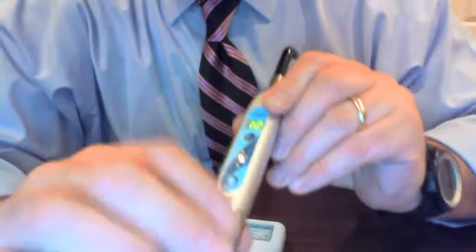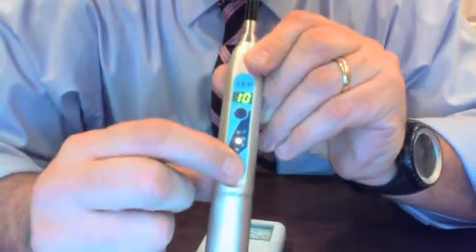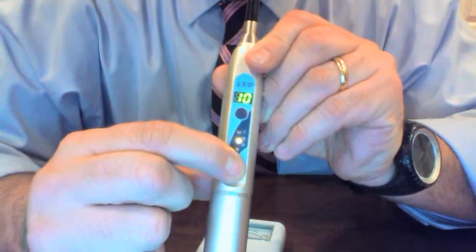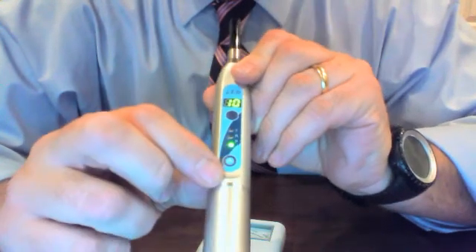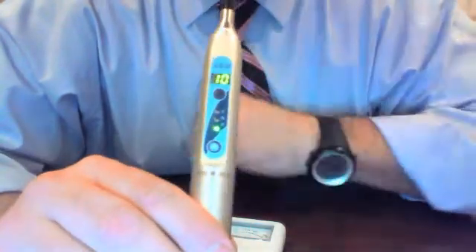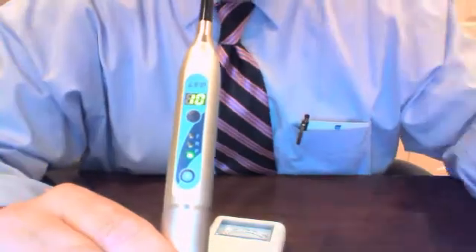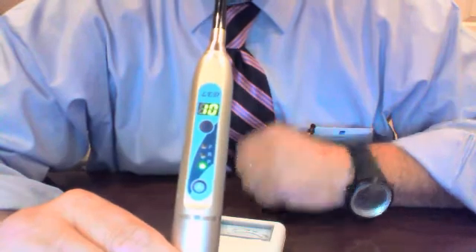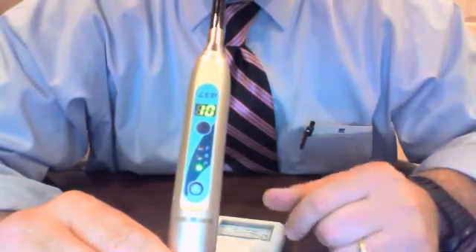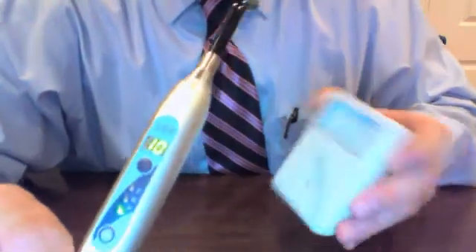The final program is the pulsated mode. I hold down the bottom button for three seconds and now I'm in pulsated mode. The pulsated mode has its applications and some clinicians prefer it. This will toggle between a weaker power and the maximum power back and forth, allowing you to get an even cure throughout the entire composite you're working on — very applicable in larger composites over three millimeters.